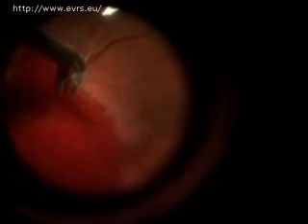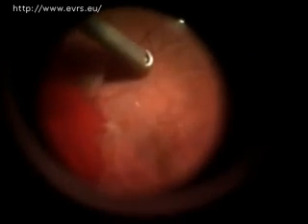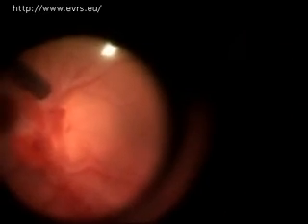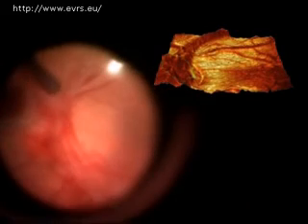If we look at the clinical appearance during vitrectomy, we see a blood clot connected to an opacified and detached ILM. We observe intense bleeding from the upper vascular arcade when the ILM is removed. This observation additionally confirms that the observed structure is ILM.